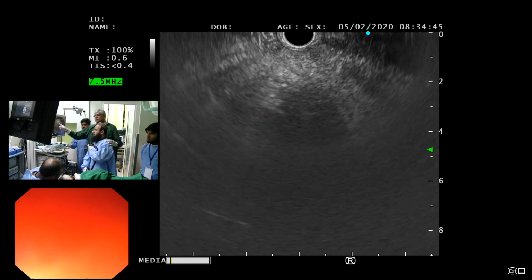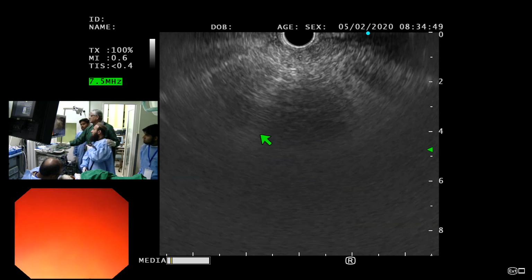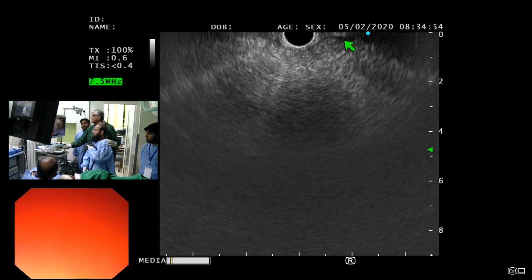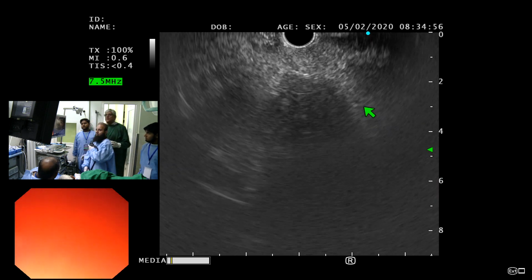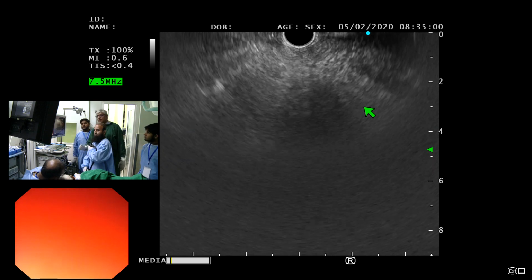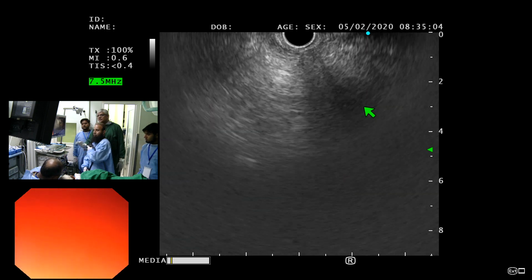You've got one of the ducts right there. So you see the ducts. Are we with you guys? So ducts in D2 start coming in this area, okay? So this is one of the ducts that's coming, that should be the CBD. Okay, so now just gently let go of your big wheel. Tip forward a little and keep the clockwise rotation. You don't change your clockwise.